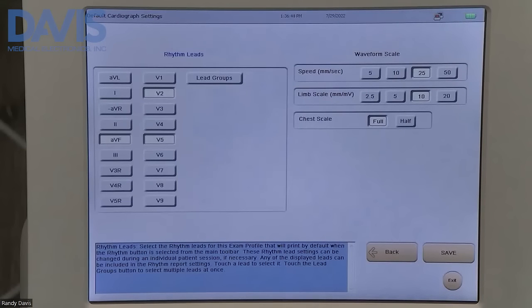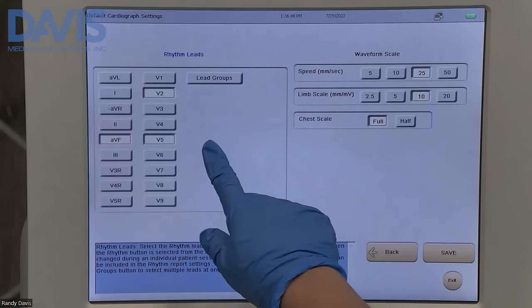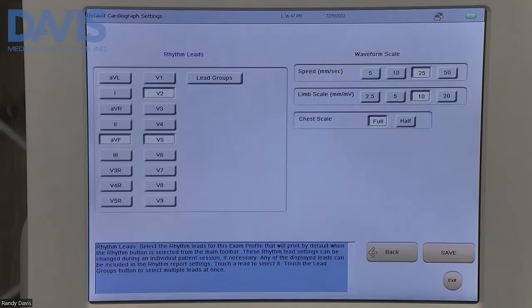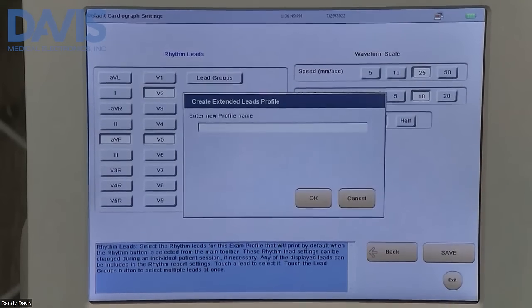This page allows you to select your rhythm leads. Once you've made the necessary changes, go ahead and click save.